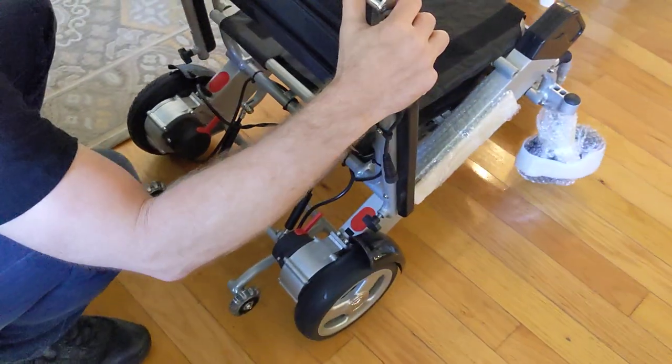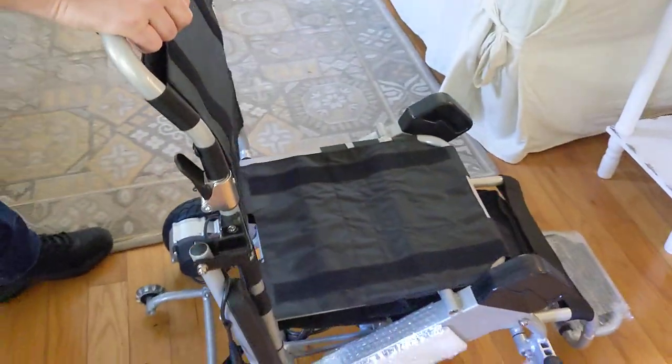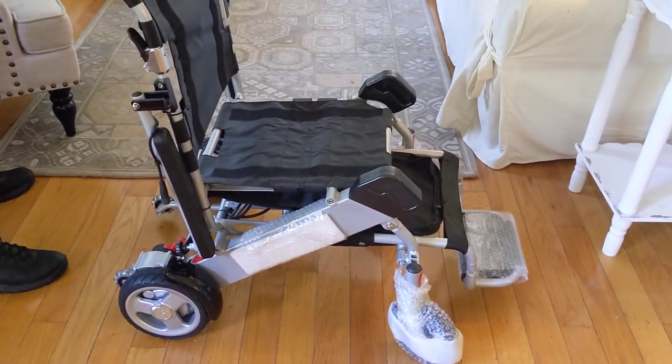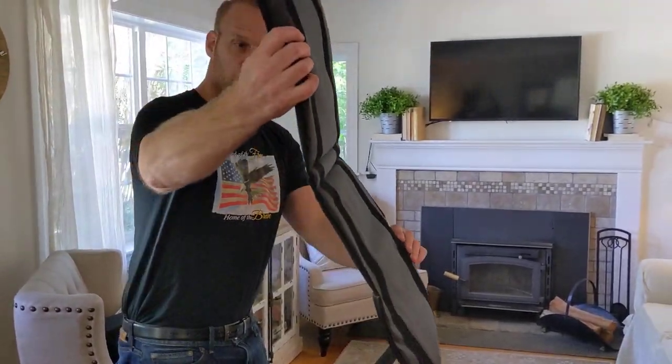Now let's take a look at the actual plug in the back of the chair — red goes to red, black goes to black — so we're going to very quickly and easily plug the chair into the battery. That's done. We have the levers right there, so the chair is either in freewheel or in power mode. And I bet you're wondering where the joystick is.